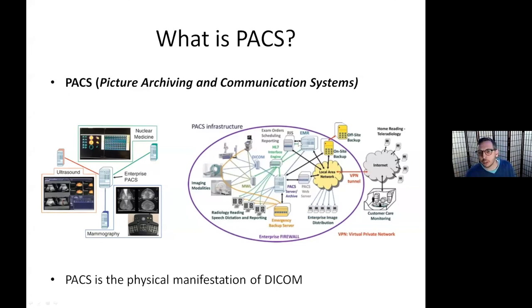And for a large hospital network like mine, we're all over the state of Ohio. I've got 11 linear accelerators, and they're all in different parts, and they all need to communicate together. So the data from all those different hospitals go into PACS, and we can share the different patient information.